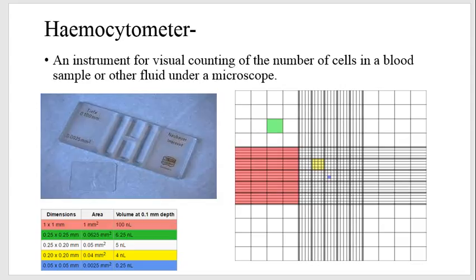So inside the hemocytometer, like I was saying, there are 9 major blocks. Inside there are 16 blocks on 4 corners for WBC count. There are further 25 blocks inside a central chamber, which is further divided into 3 lines and 16 sub blocks. Now we have to count for each 16 sub blocks, and out of 25 we can count any 5.